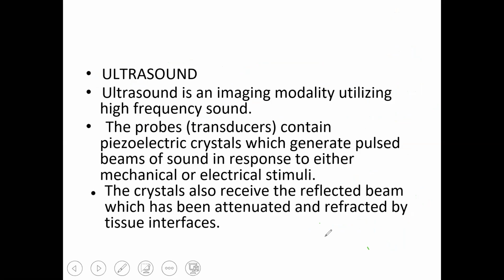Now we are going to see ultrasound. Ultrasound is an imaging modality utilizing high frequency sound. The probes contain piezoelectric crystals which generate a pulsed beam of sound in response to either mechanical or electrical stimuli. The crystals also receive the reflected beam, which has been attenuated and refracted by the tissue interfaces.